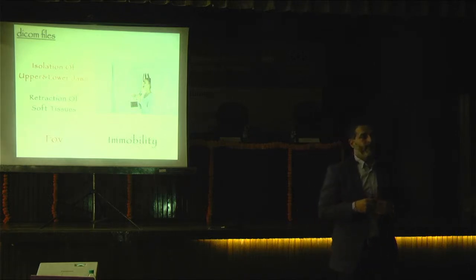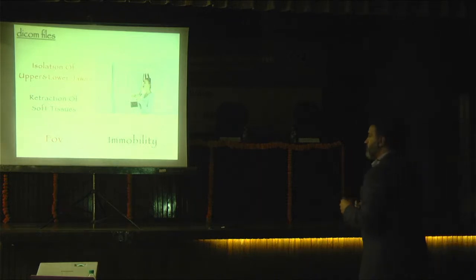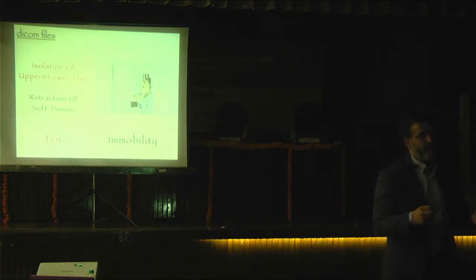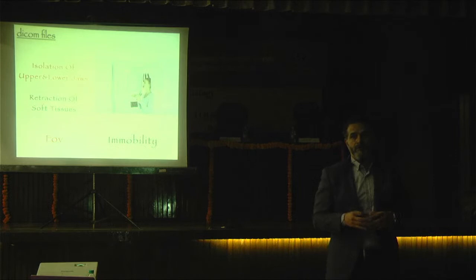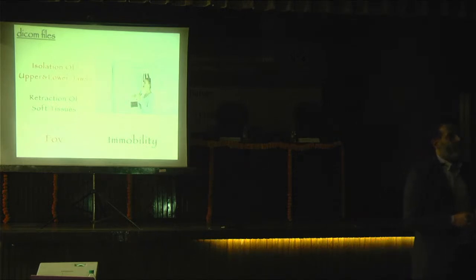We have some rules, and I will show you a picture, which is very important, and I want you to take the picture. When you want to make a guided surgery, when you send us a DICOM data, please do not get the CBCT normally. We have a different method. The isolation of the upper and lower jaws is very important. Retraction of soft tissues is very important. Field of view is very important. And immobility is generally very important for getting the CBCT.